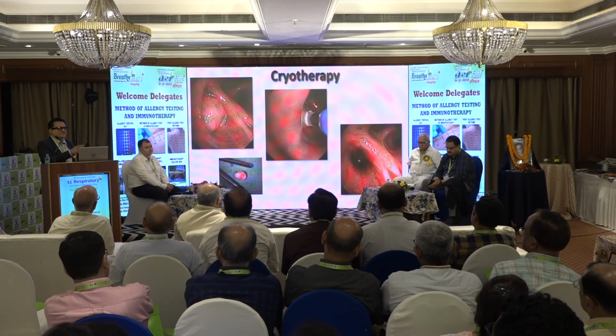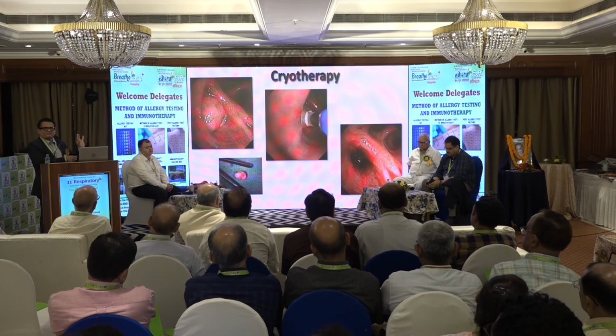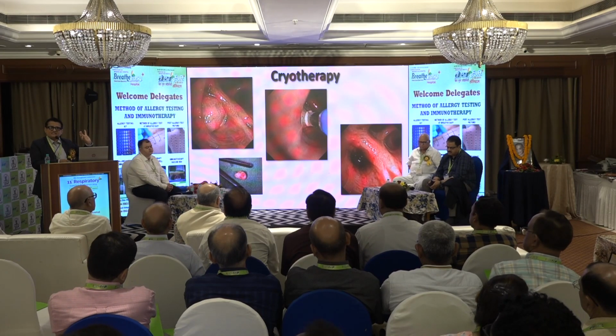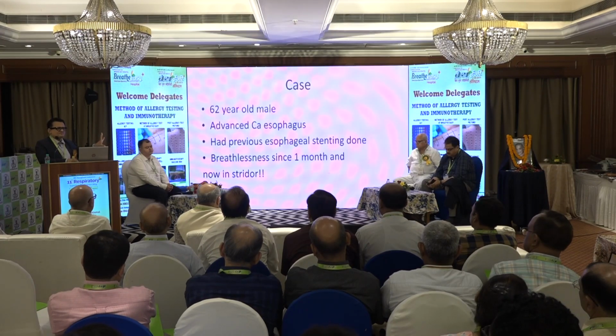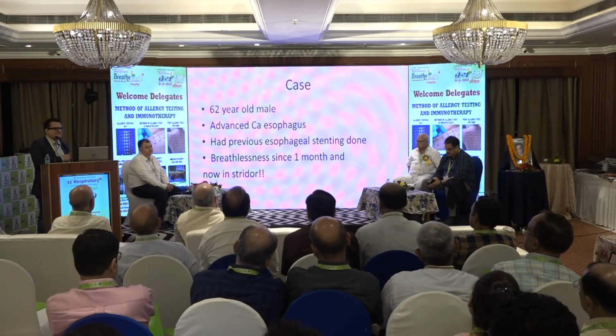I'll go ahead. You can use cryotherapy also to remove these tumors. I showed you cryolung biopsy. The same technique can be used to remove tumors, and the same technique can be used to remove foreign bodies also. Quickly, a couple of slides more.